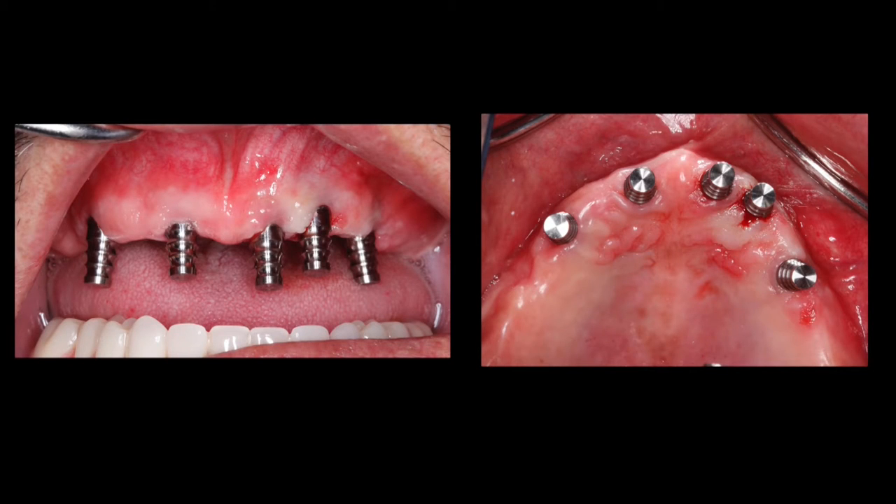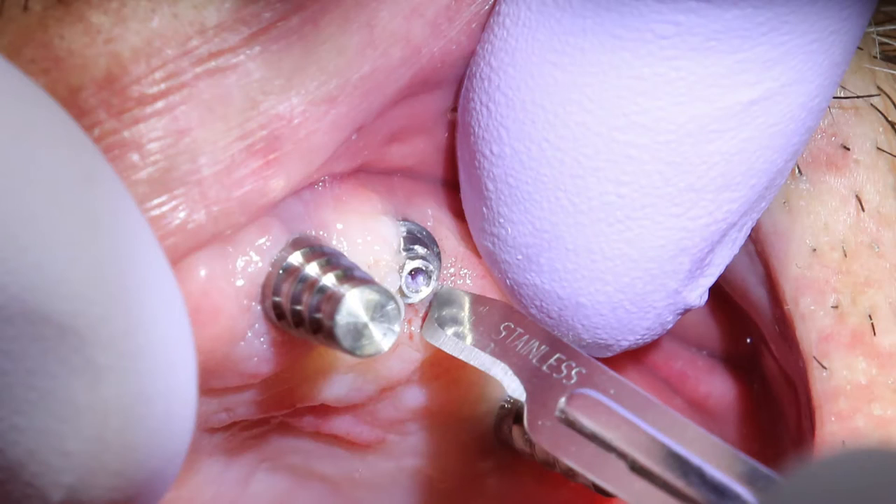I was able to place the closed tray impression copings without much tissue removal. You can see on the patient's maxillary left canine area, I did have to remove a little bit of soft tissue to access the shoulder of the multi-unit abutment.